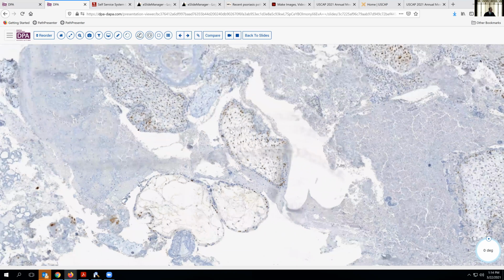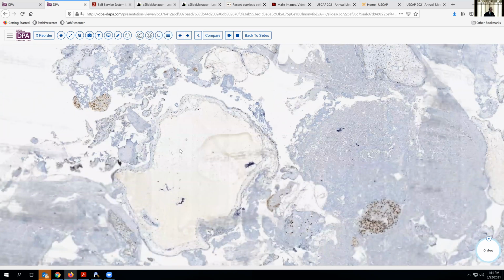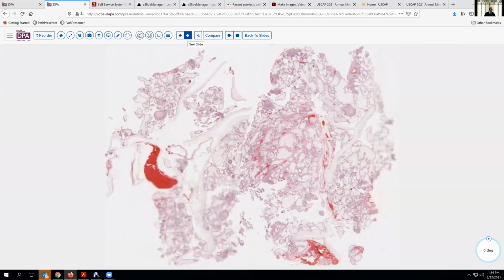So we can presume that this does have maternal DNA, and with the degree of cistern formation, we could presume that this is a partial mole. Now we might go further on that, and we'll talk about the workup. Let's look at another example first, however.